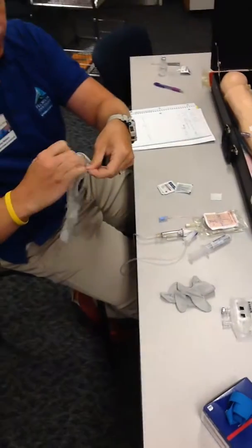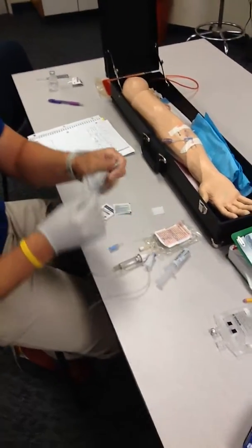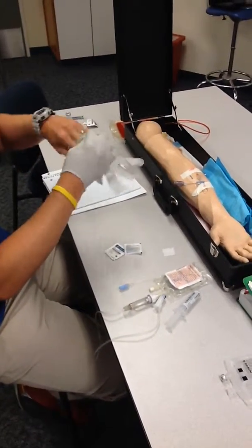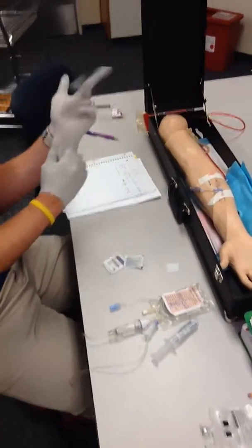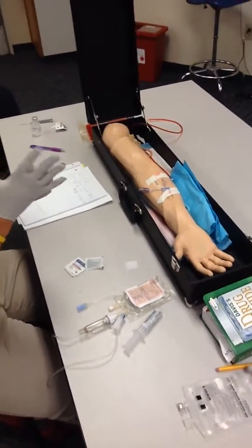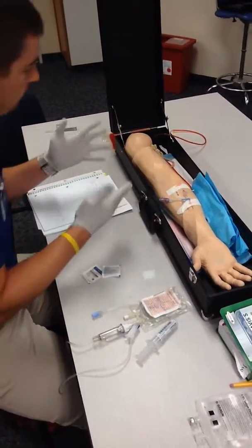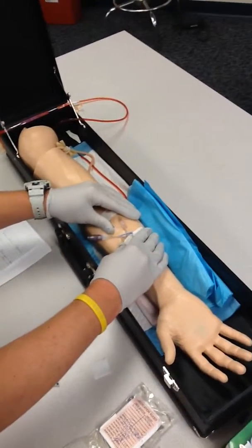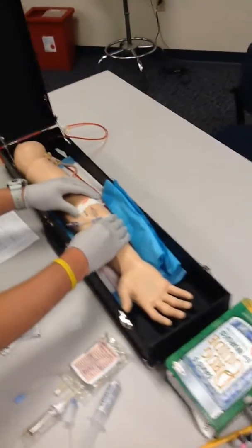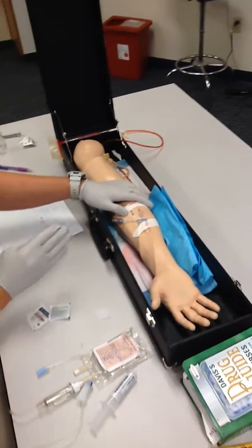So I'm going to wash my hands again, and I will apply clean gloves, not sterile gloves. How are you doing today, Mr. Jones? I'm going to be administering your Vanco today. Have you had that before? Well, it's a pretty potent antibiotic to treat the infection that you have. As I'm talking, I'll check the site. I don't see any infiltration, no phlebitis, no tenderness. Any pain here, sir? No, nothing more than having something in your arm as it is.